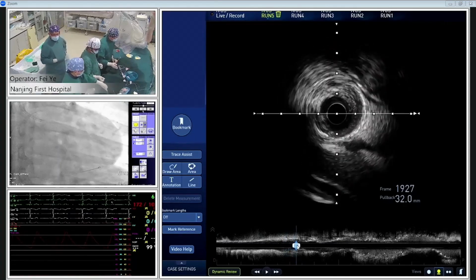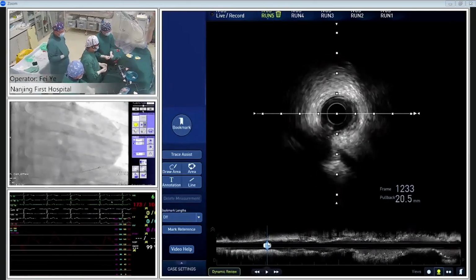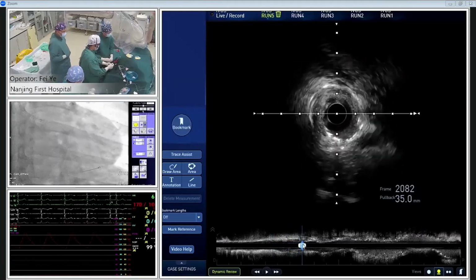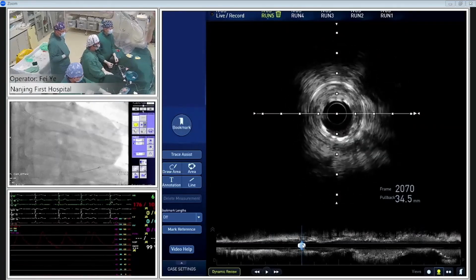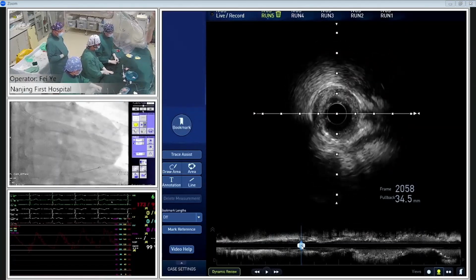Is there any landing zone of the distal? No. The distal is too small. Vessel very small. Maybe we can do the long time inflation and check angio again. But TIMI flow is okay. Could you show me the distal part, stent edge to the normal part of the distal circumflex?